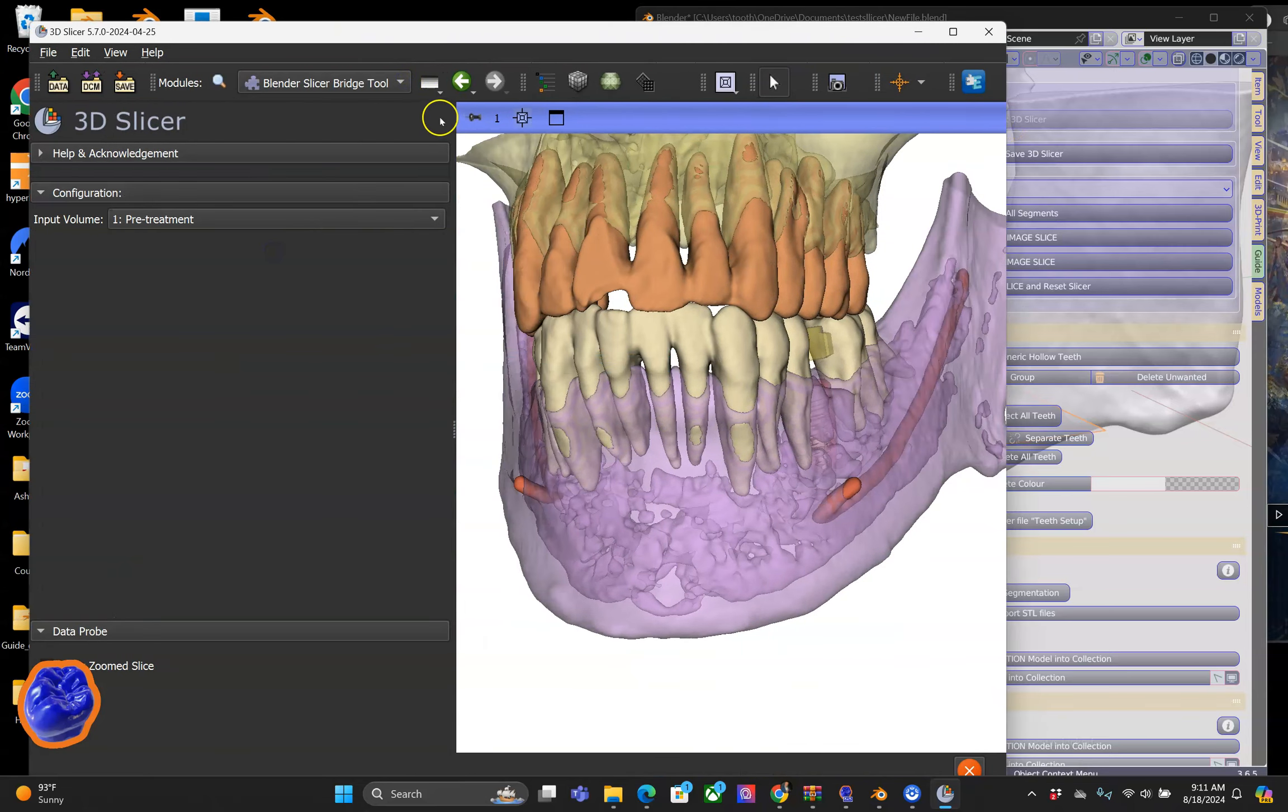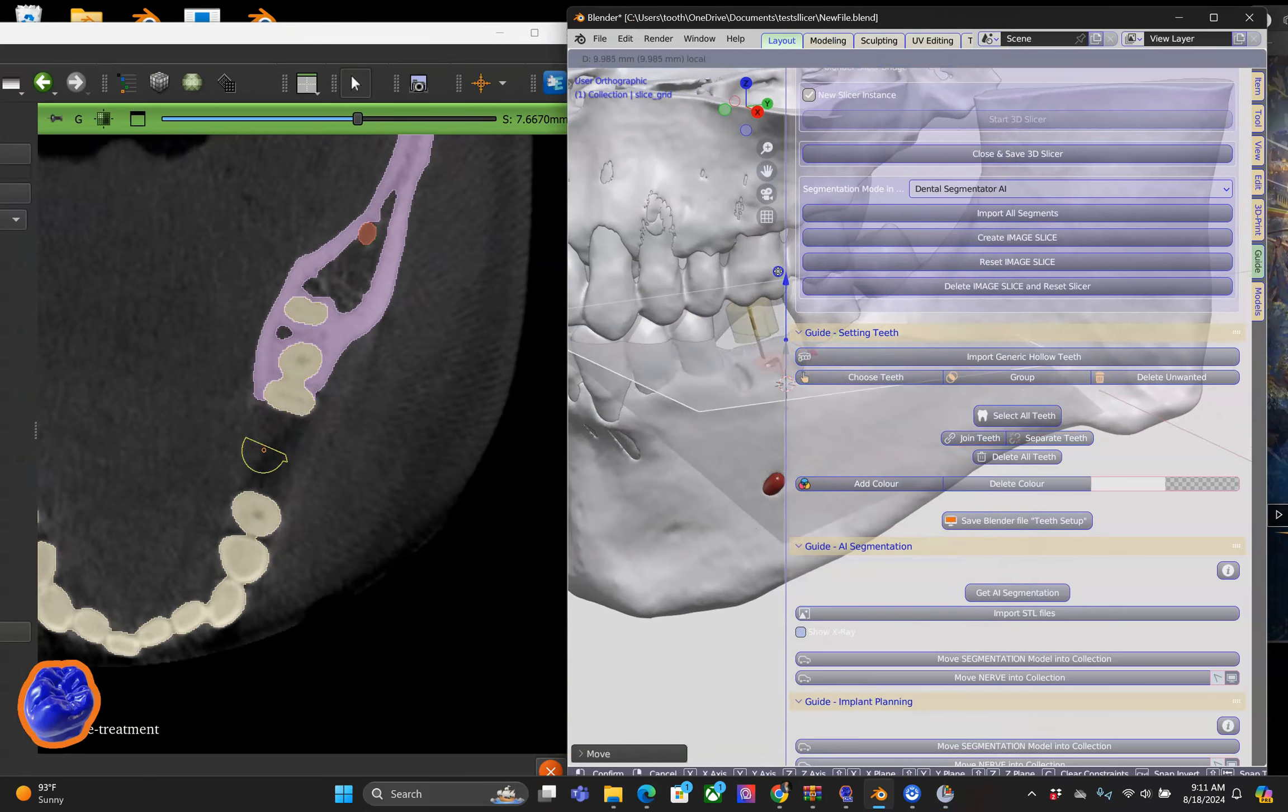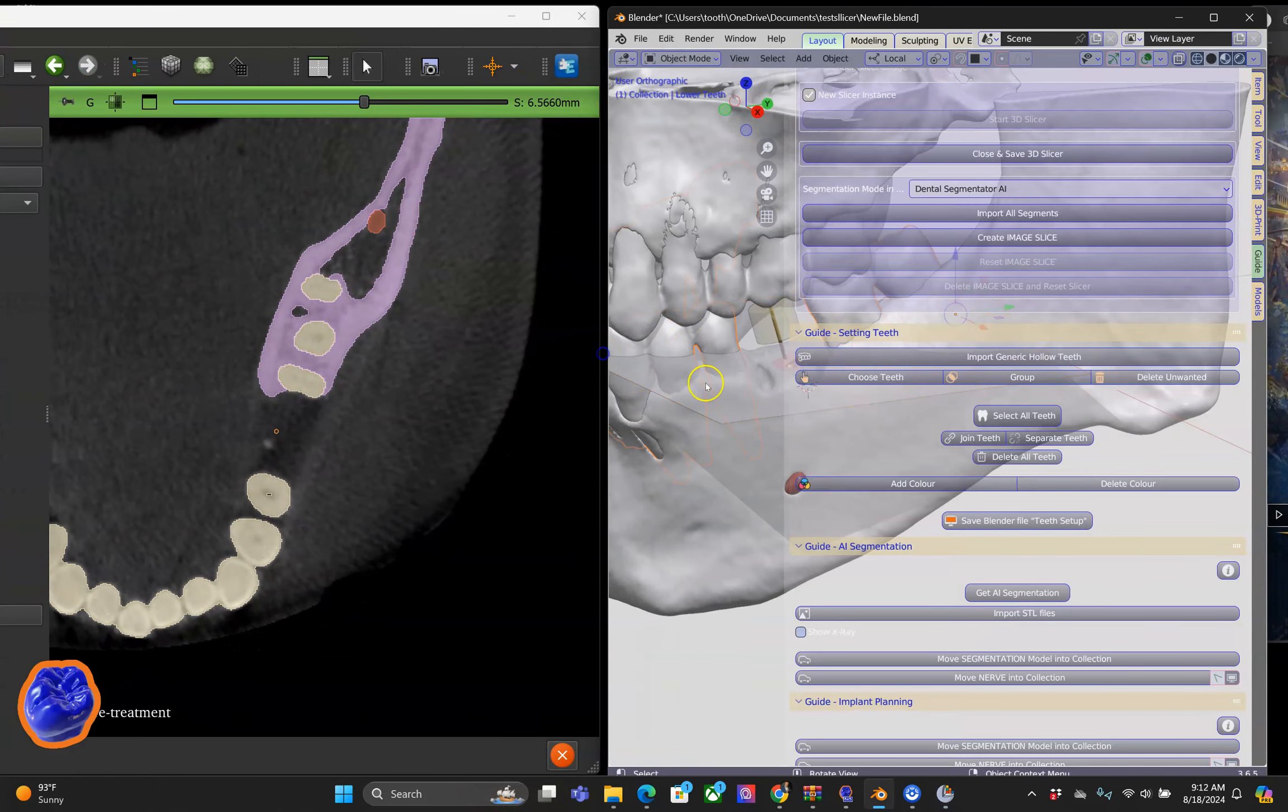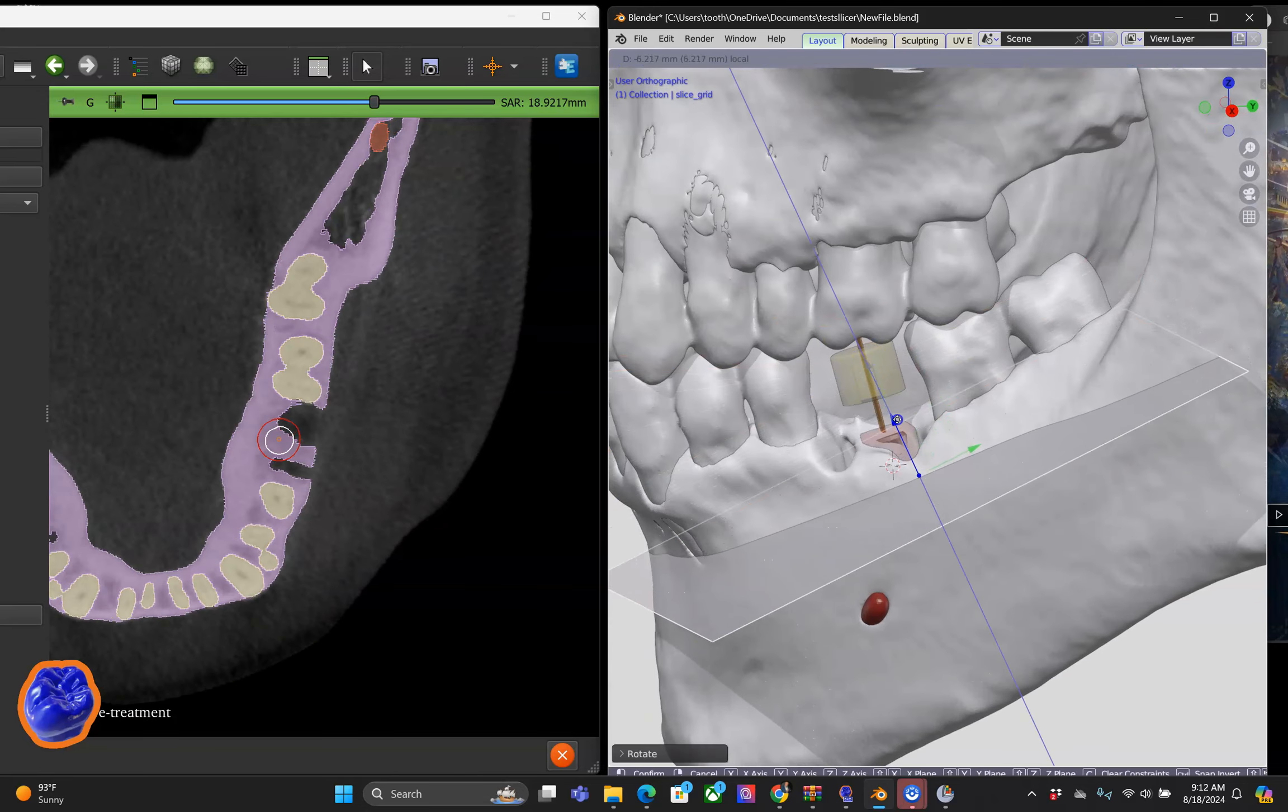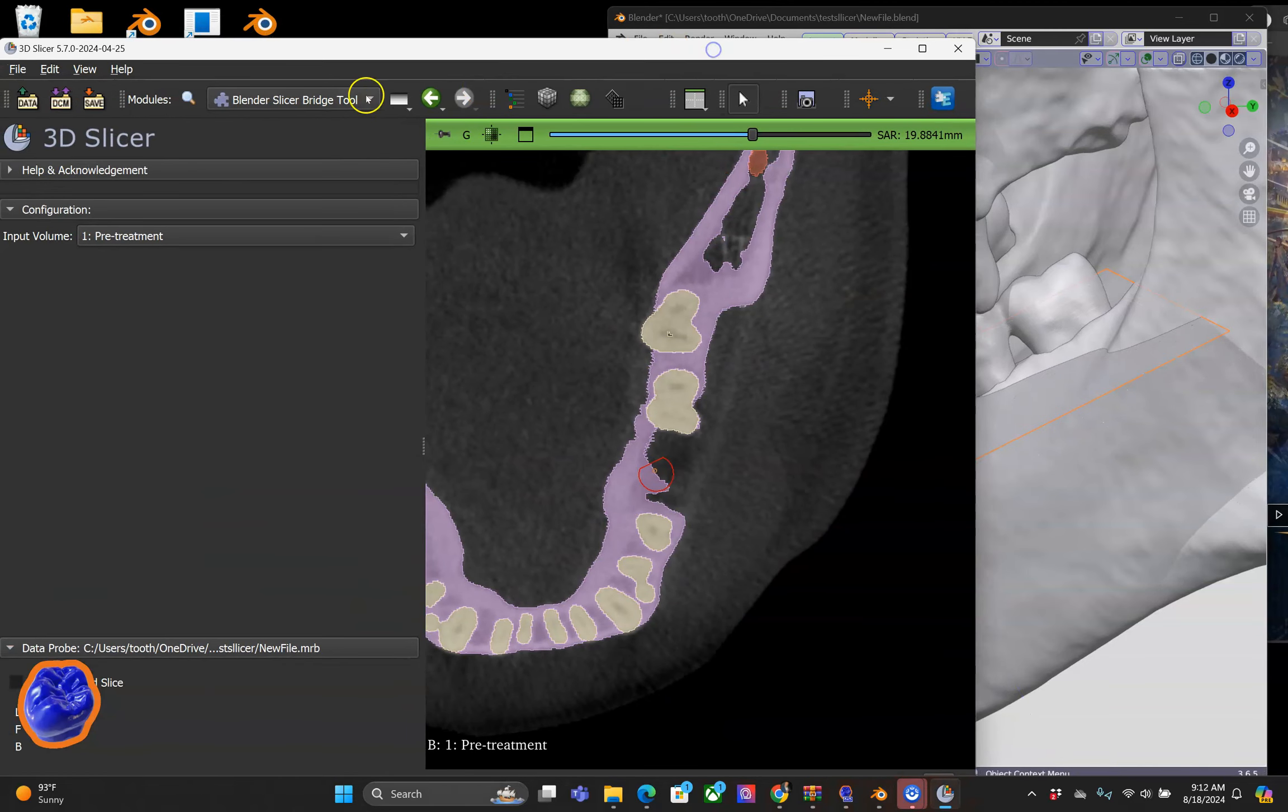I'm now going to switch over to the green plane in 3D Slicer. The cross-sectional plane in Blender controls the green plane, so as I'm moving the plane up and down, we get a full view on the left hand side.